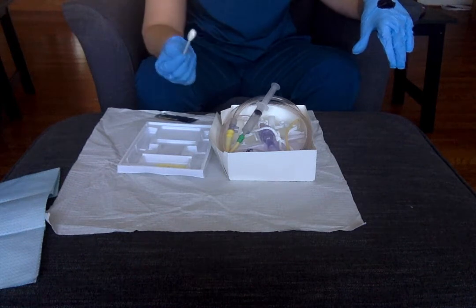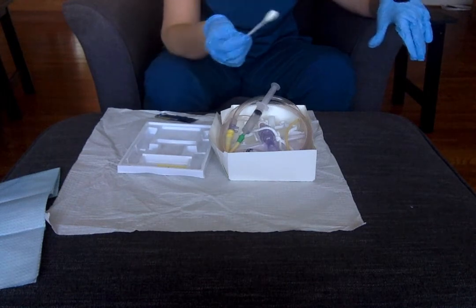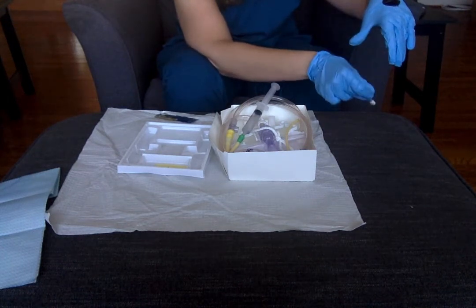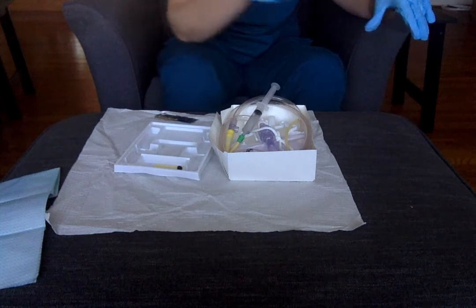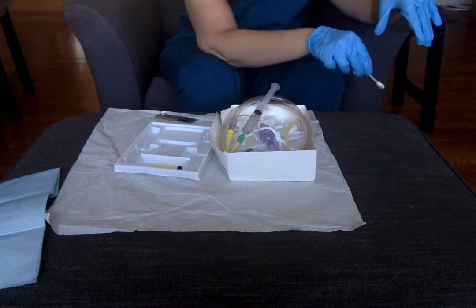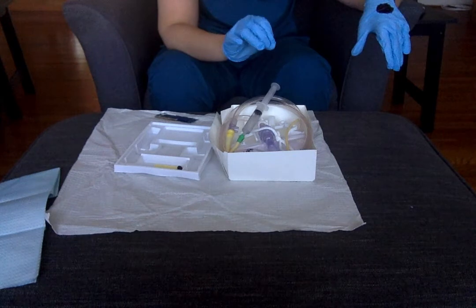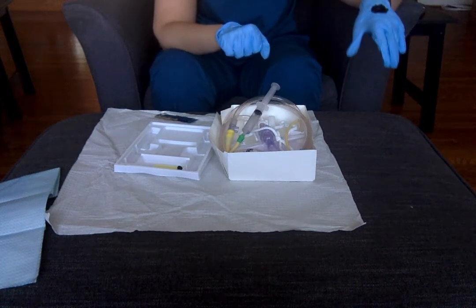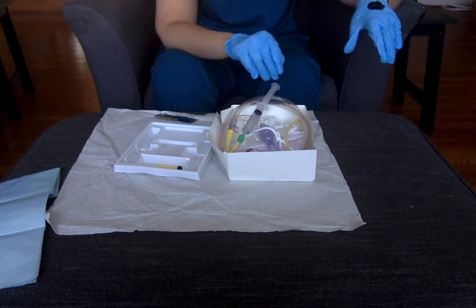When I clean — I'm right-handed, so I always stand on the right side of my patient. That way, when I pick up my catheter, I can just put it right in. For cleaning, you're always going to clean the side furthest away from you. So you start at the top inside the labia minora, go top to bottom in one swipe, and toss it — we're not scrubbing, just one swipe. Grab your second one, go top to bottom, trash it. Grab your third one and go straight down the middle. This is where you'll sometimes see the urethral meatus kind of wink or blink at you, forming a little bubble over the surface that pops. Notice you can never let the labia touch again once you've cleaned. Same thing for a male — you can never set the penis down again because if it touches anything else, it's dirty and you have to clean all over again.